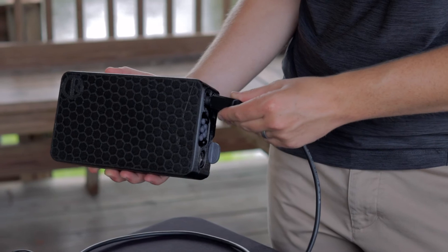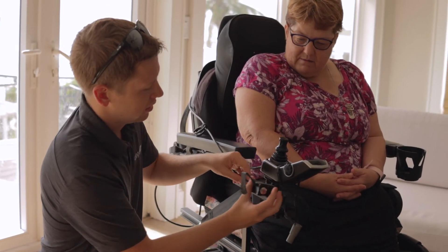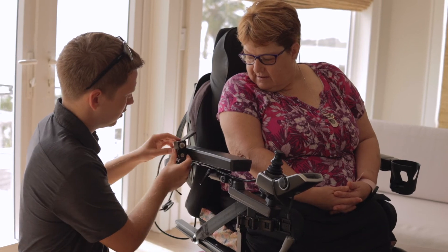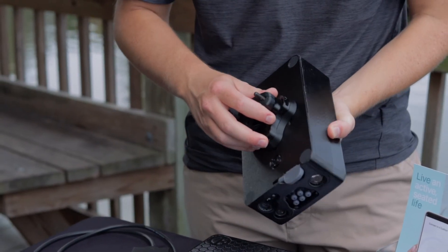With the use of our extender, individuals are able to adjust where the power port and the on and off switch are on the unit, so that no matter where they mount it they can ensure that these two functions remain accessible. Additionally, the unit comes with a mount so that it can be secured on the wheelchair itself.